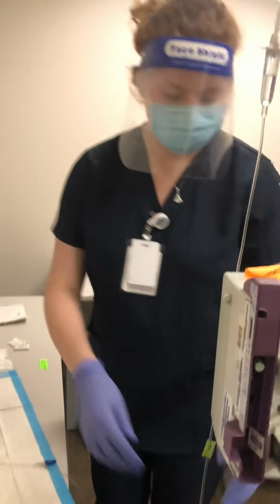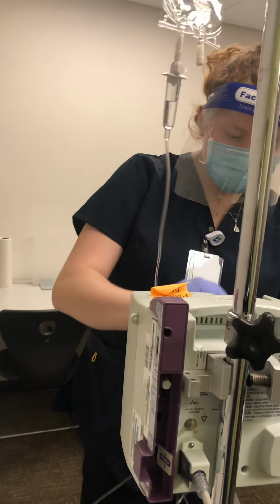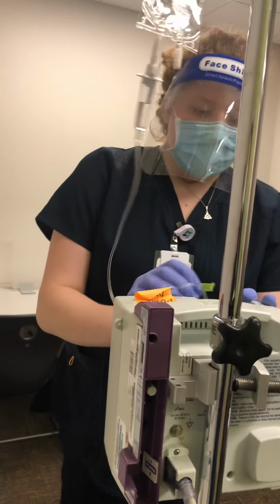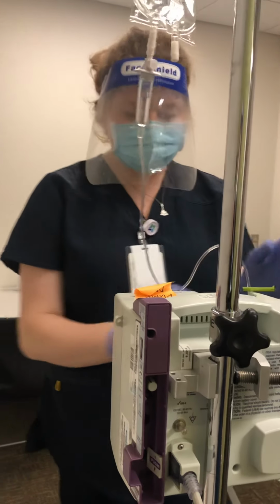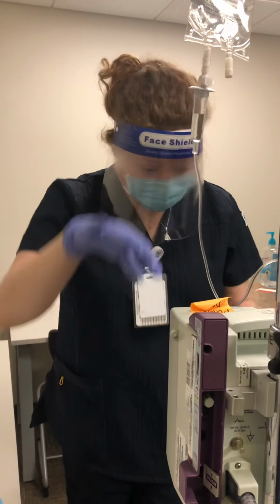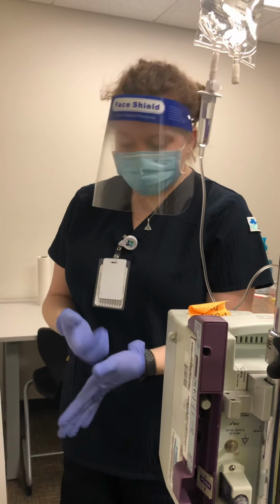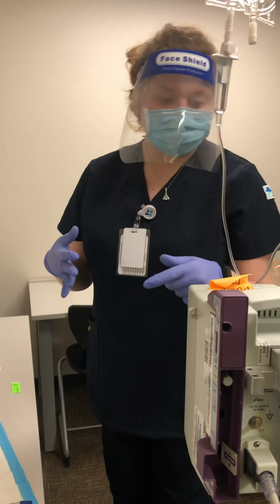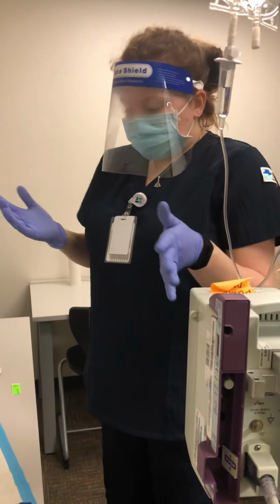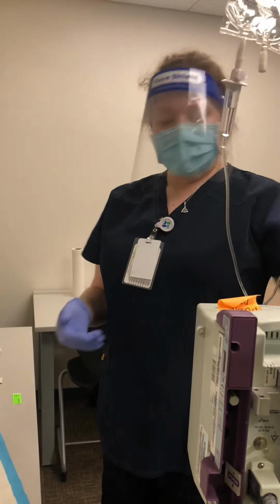Undoing your lock. We are putting this cassette into our IV pump. Okay, come on, there you go. I'm doing this, and I am setting the administration rate for 125 mils per hour for 2 hours for a total volume infusion of 250 mils. So Shirley, that is, again, programmed and started and going.